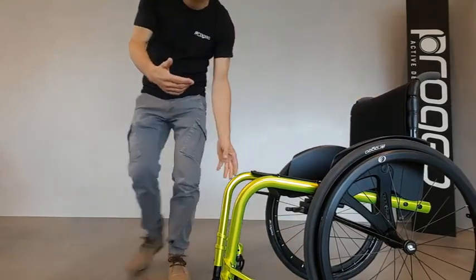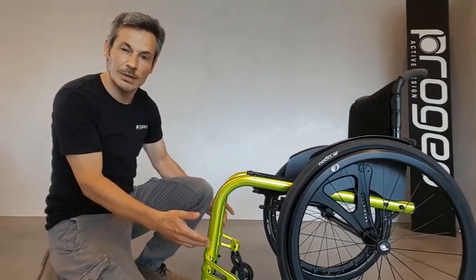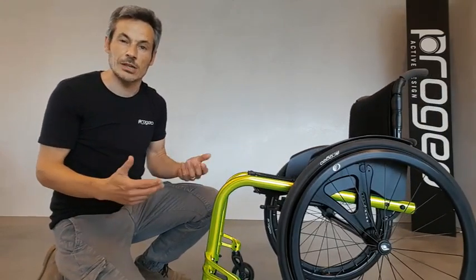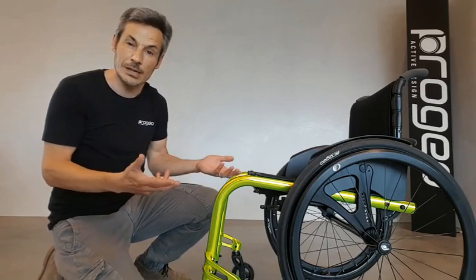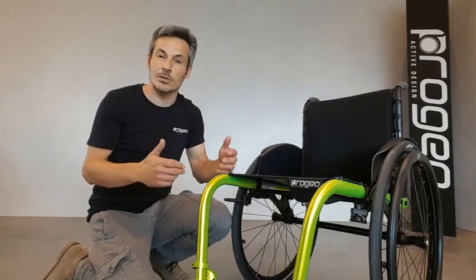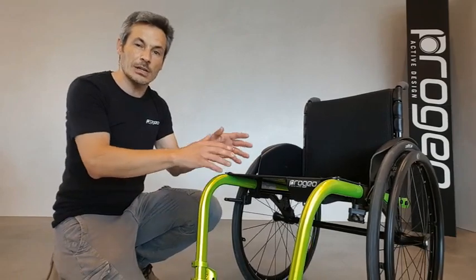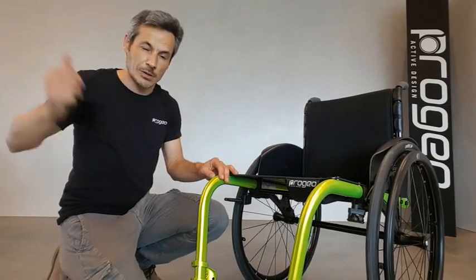Its linear and accurate design, elegant and sporty at the same time, offers great characteristics in terms of lightness and maneuverability. Multiple adjustments and uncountable numbers of possible configurations and personalizations make this model an elite product.